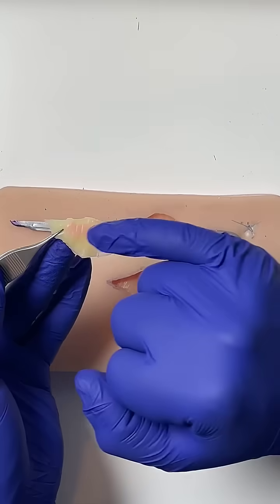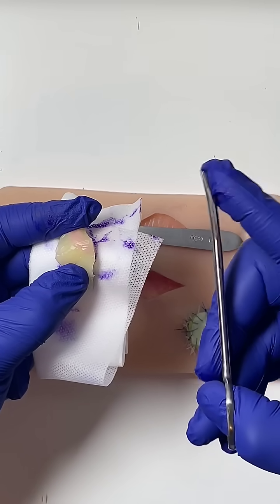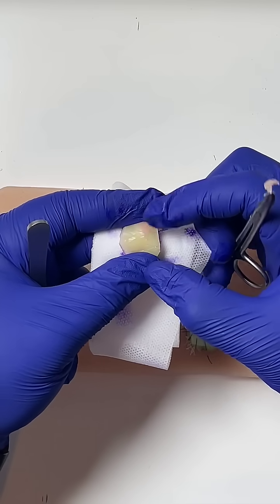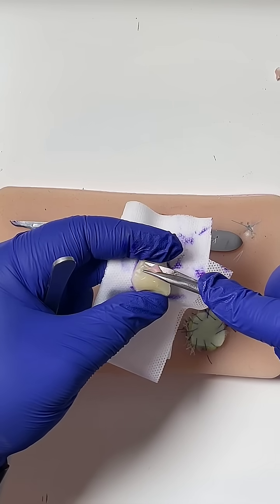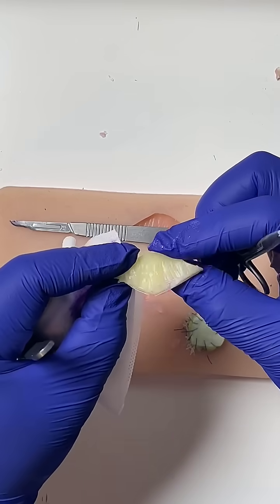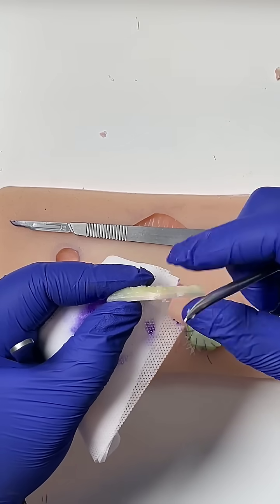Now we want to trim off the unnecessary tissue, which is that pink stuff there. Put a good amount of tension between my thumb and my index finger. Get the tenotomy — this is the curved scissor, it's got a curve on it. You just want to take little bites of that tissue under tension, pushing the skin apart and cutting just the bit you don't want off with just the tip — not the whole body, just the tip.